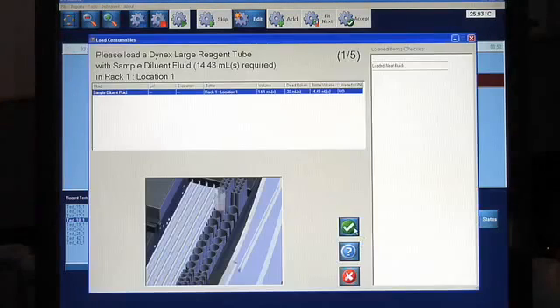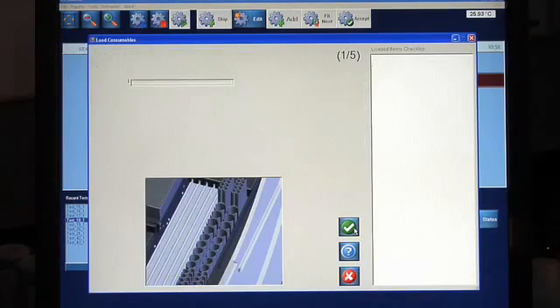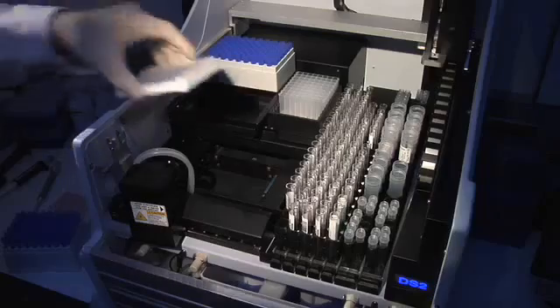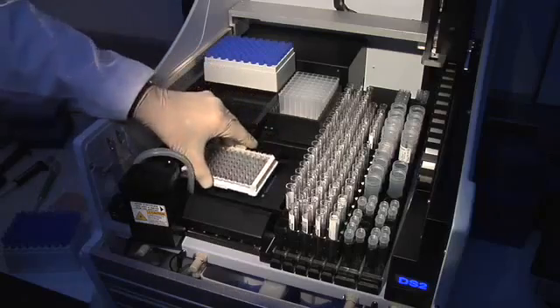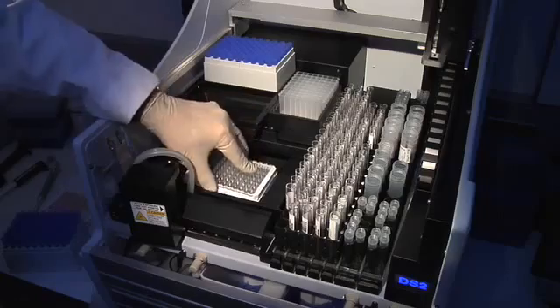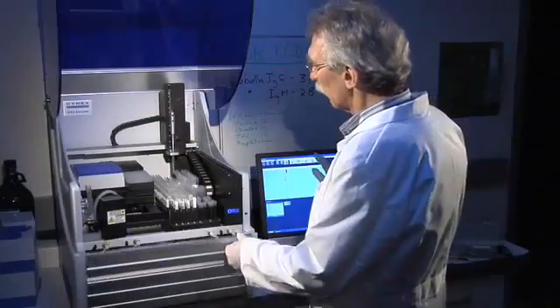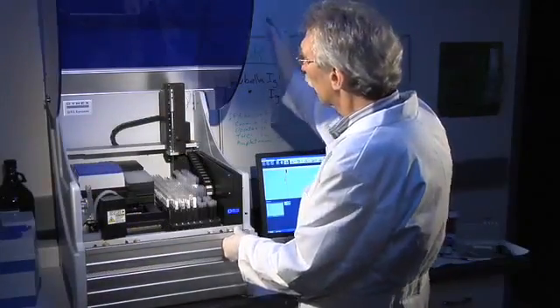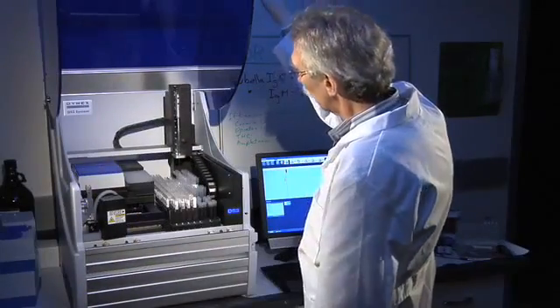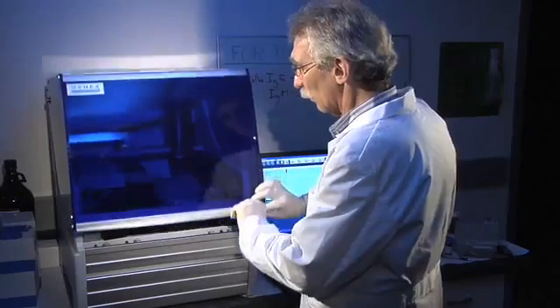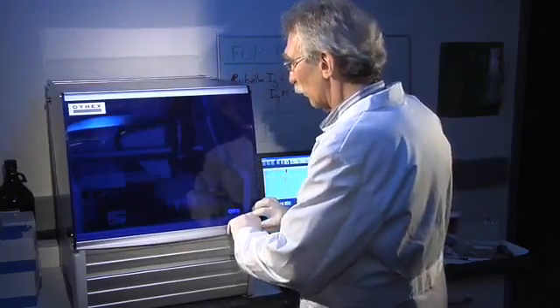The Dynex Load Wizard prompts you to insert the items required for the selected assays. Animations show the operator exactly where to place each item. Once filled with samples and consumables, the DS2 will take over all operations, freeing the technologist to attend to other tasks.